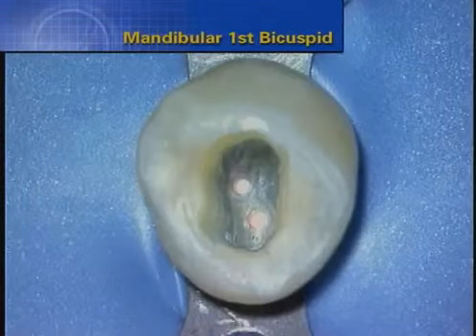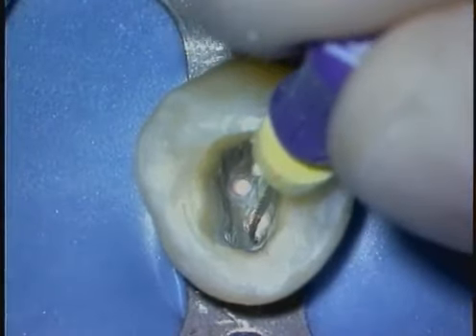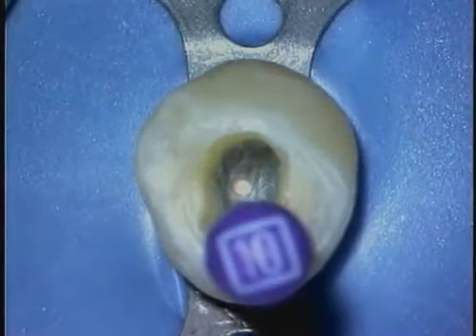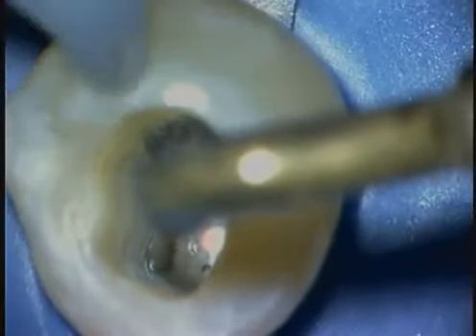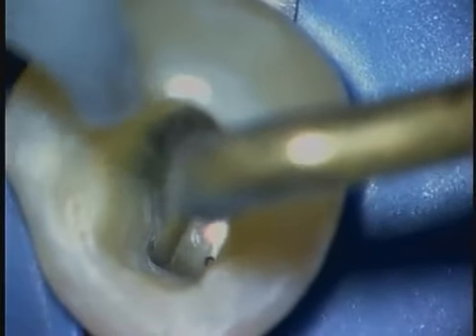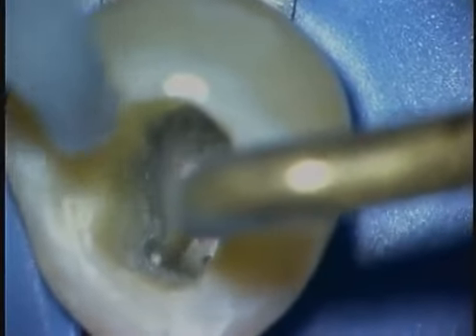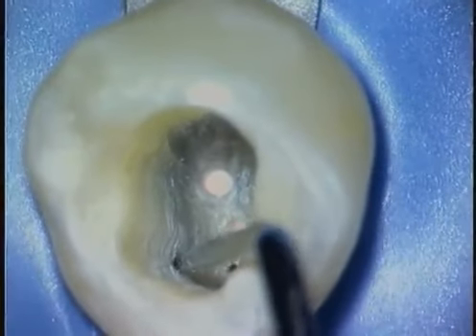As a group of teeth, mandibular bicuspids notoriously hold internal bizarre anatomy. Frequently, radiographs reveal one root, but oftentimes these roots are very broad buccal to lingual. Access into these teeth is straight line, but a lot of times we're working so far below the occlusal table that access cavities have to be further expanded to provide deep views. Remember, an expanded access cavity isn't just for the convenience of the operator, but it gets more light deep in the tooth so one can see.